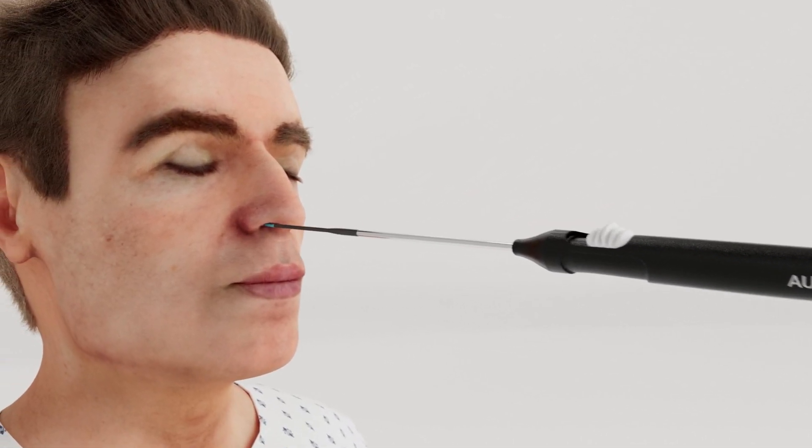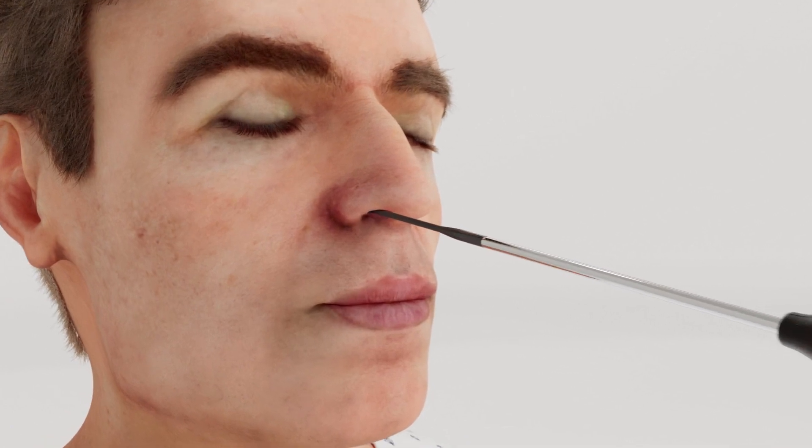Before dilation, visualize to ensure there are no occlusions or a patulous Eustachian tube.